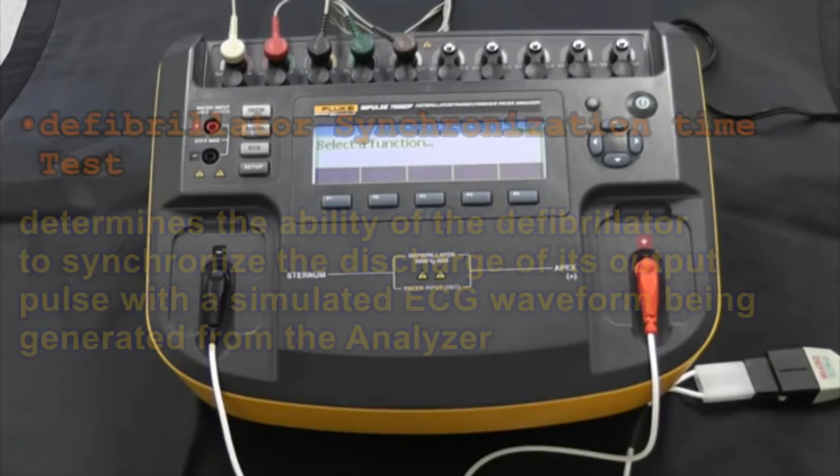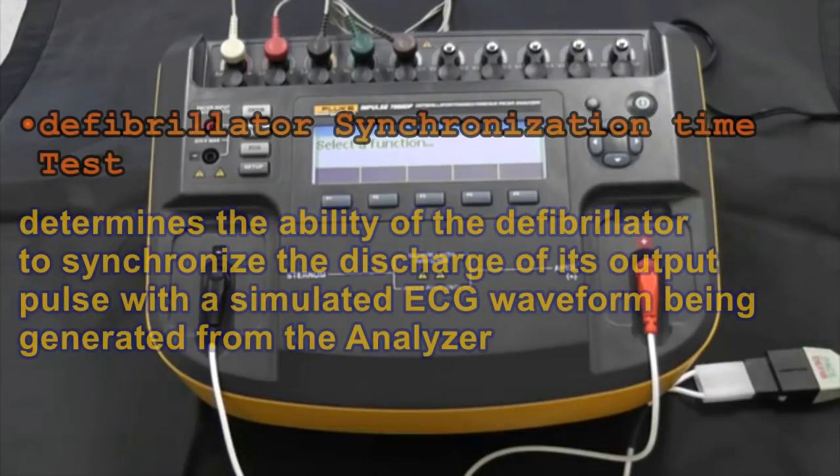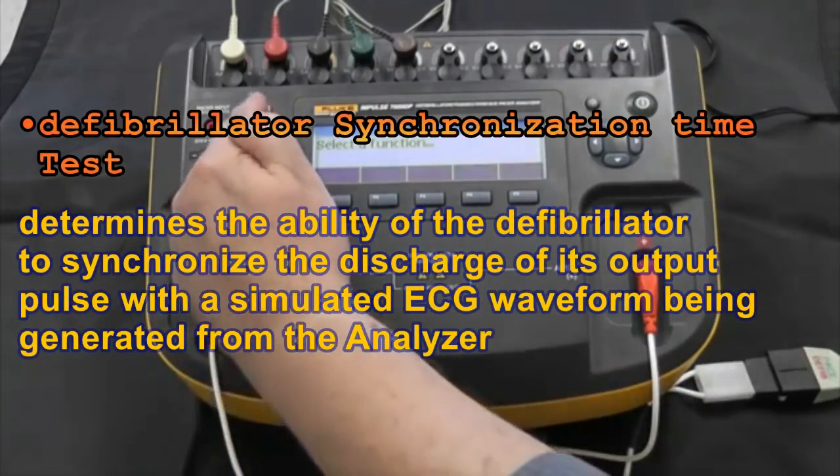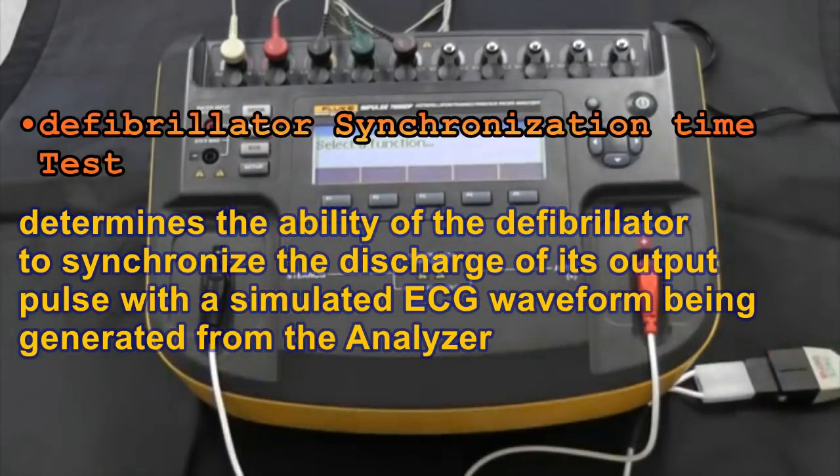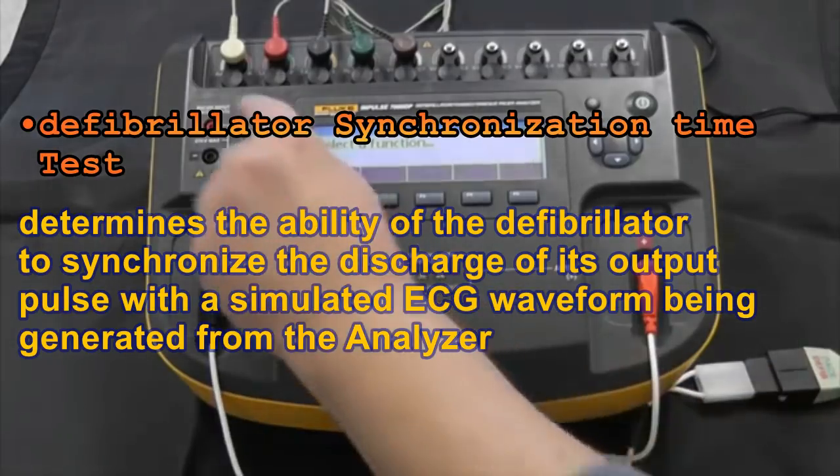So how do we select what we want to do? You can see on screen it says 'select a function' — in other words, tell me what to do. We follow the function keys on the side of the screen, so let's start with defib.